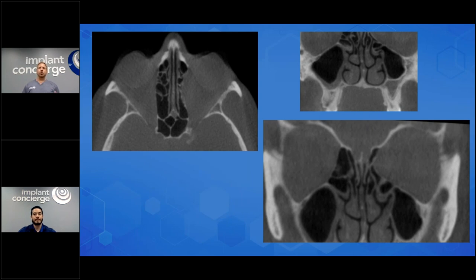The whole point is, when I see something like this, I don't want to write a report and then scare the patient or scare the doctor. I want to give them something that they can work with and not be like, oh, look what I found, and that's it. So I look at the volume. I try to use all the pieces that we have here. Again, the maxillary sinus is slightly smaller. It seems like such a nice dome-shaped inverted papilloma, it's possible. The only thing is I really do see the wall of the ethmoid air cells. You can see that it's coming from the orbit, it appears. But those are all really good differential diagnoses, absolutely.